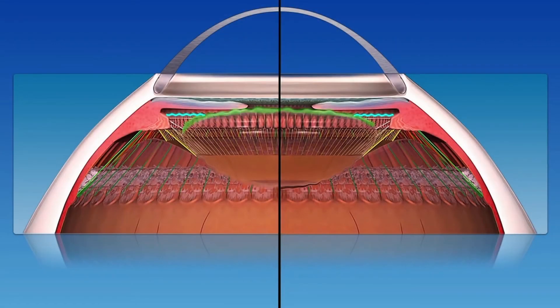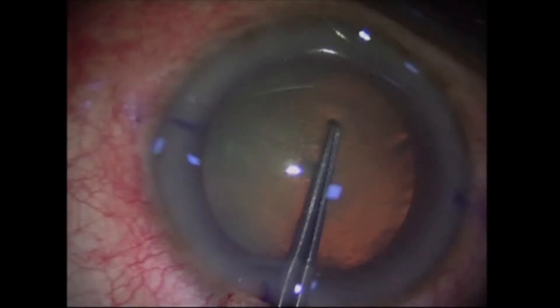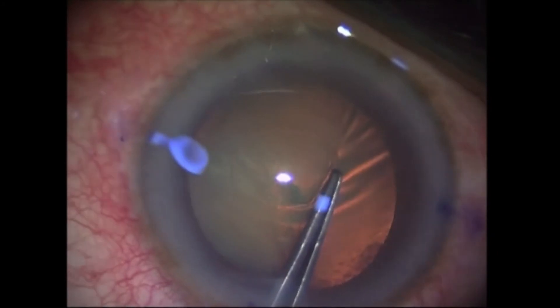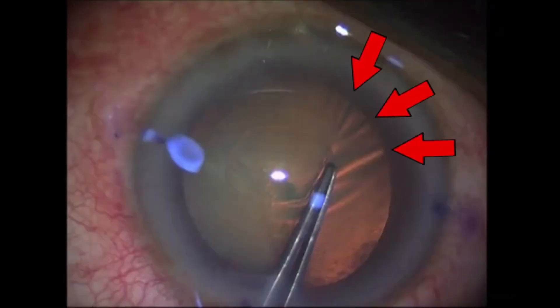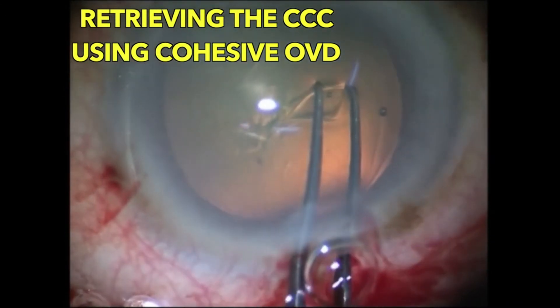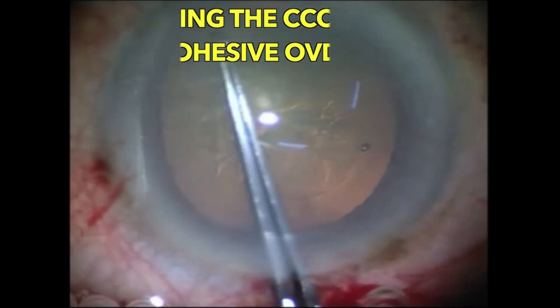But if only the anterior zonules are weak, then my dear friends, you all may be left shell-shocked. When you perform the all-important capsulorhexis, there is traction, no counter-traction. The anterior capsule will show the wrinkles, and she will try hard to extend and just run off. If you're not careful, she will desert you, and to the equator she will quickly take off.